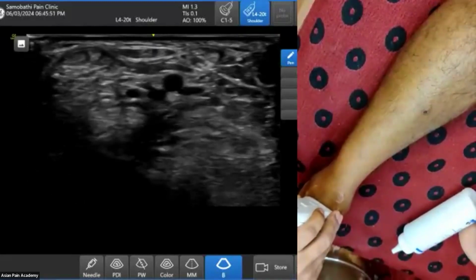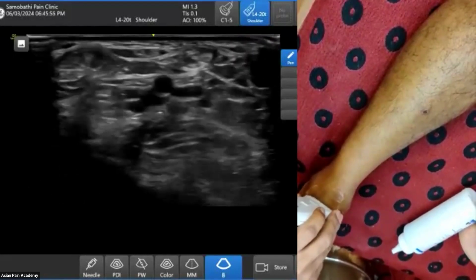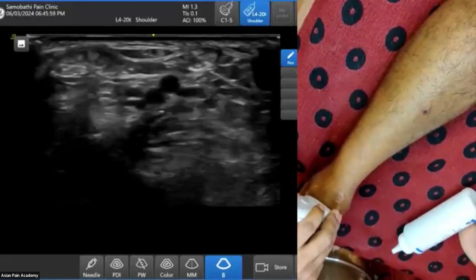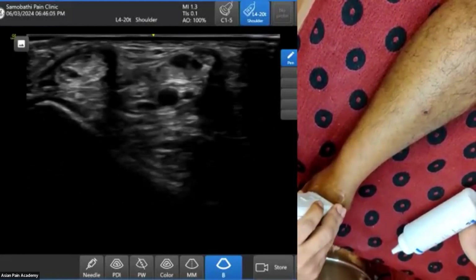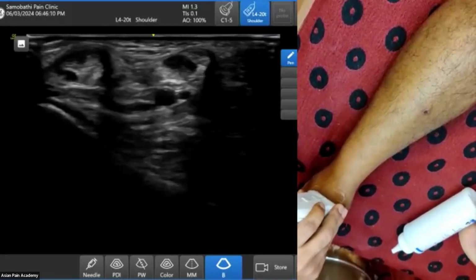But in this area, in between, the middle part is the black artery, and in the right side also there is a small nerve, and in the left side also there is a small nerve. It means it has branched. But if I go up, then the nerve remains a bit bigger, but now it is just above the artery.